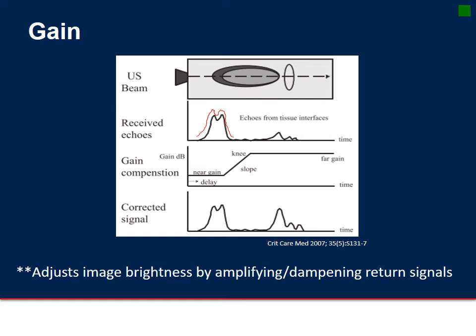And this strong signal will be interpreted as a much brighter image on the ultrasound screen, whereas the differing impedances later on is not as high, or it may be that just our ultrasound beam has attenuated to a point where the intensity coming back is not as high, and so that will be less bright on our ultrasound screen.